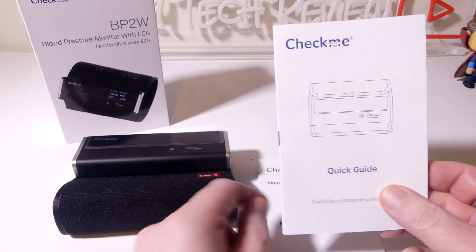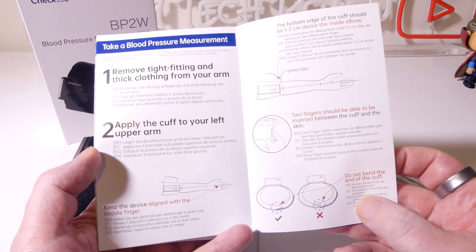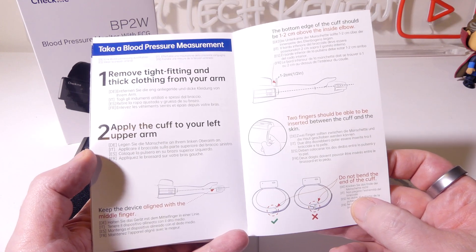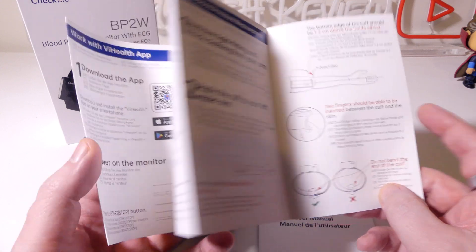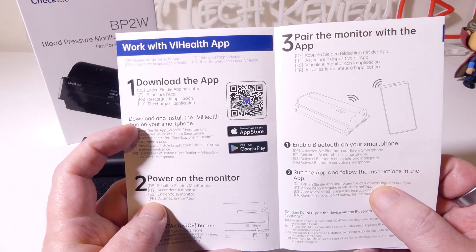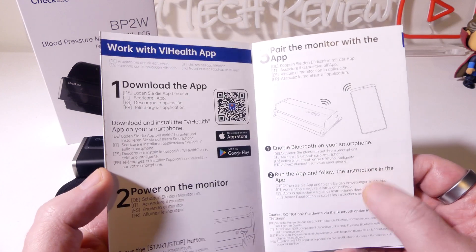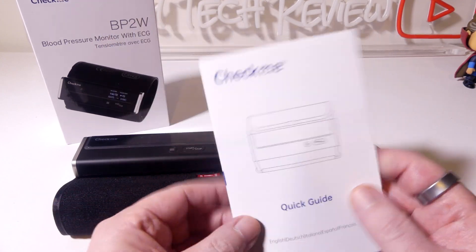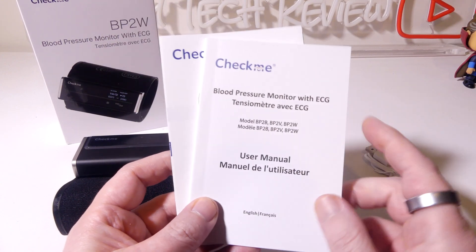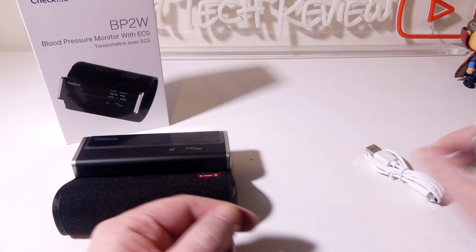The quick guide is a nice handy foldout written in English, showing you how to apply the cuff to your arm and making sure that it's lined up the correct way, how to get the app — which is the ViHealth app — available for Android or iOS, and then how to enable Bluetooth and make sure that your app is connected correctly. The user manual is in English and French and goes into a bit more detail.